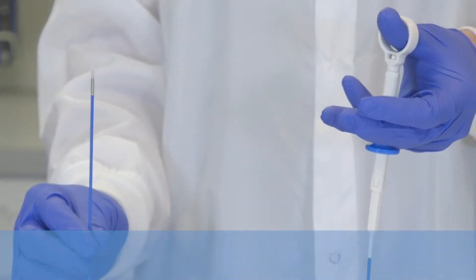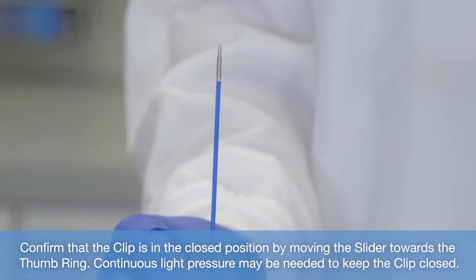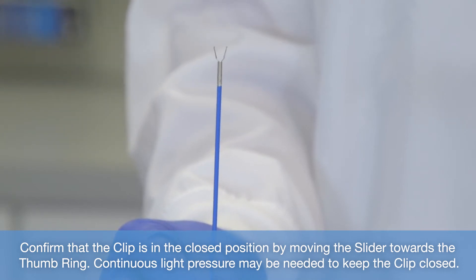Confirm that the clip is in the closed position by moving the slider towards the thumb ring. Continuous light pressure may be needed to keep the clip closed.